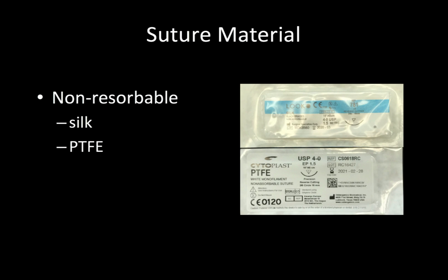For non-resorbable materials, we have many choices. Surgical silk is a general-purpose suture that is used only in keratinized tissue. It has high tissue reactivity since it is a braided material, which can wick bacteria into the wound. It is easy to use and has a fair tensile strength.